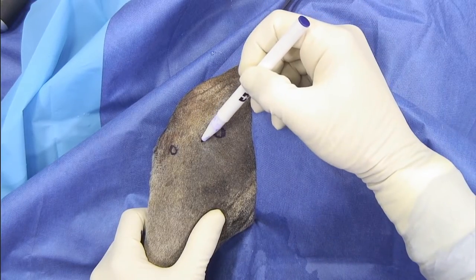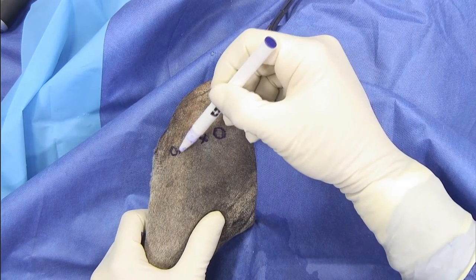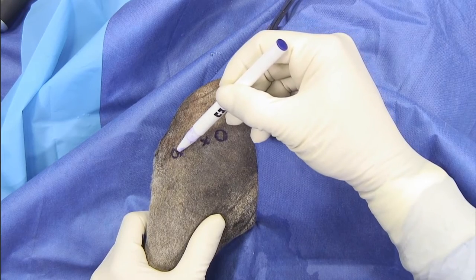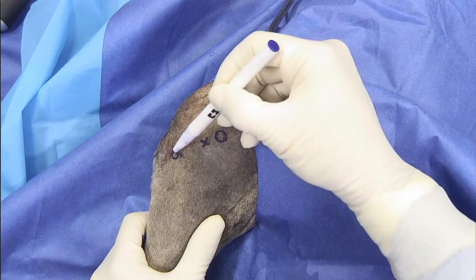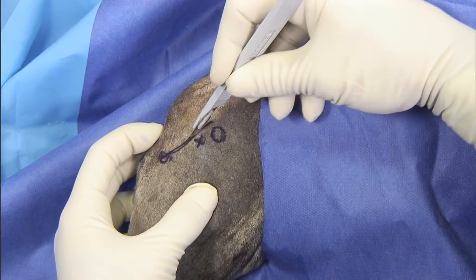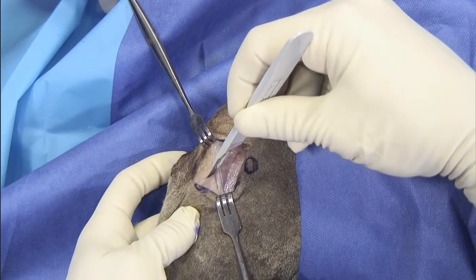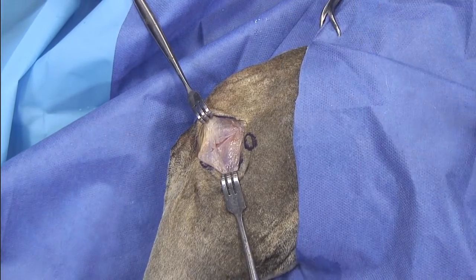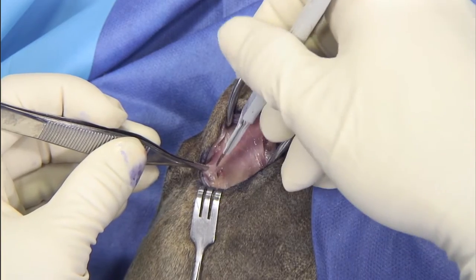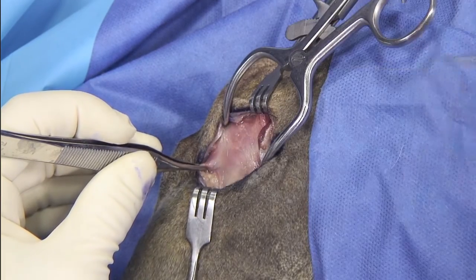We're going to place a swivel lock about in this area and we're going to make a tunnel about in this area. I need to have a skin incision that will allow me exposure of both, approximately from the Gerdy's tubercle to a little bit more cranial than the fabella right there. So I'm going to do a second incision in the fascia, making an incision right over the groove of the digital extensor until I can see the extensor.